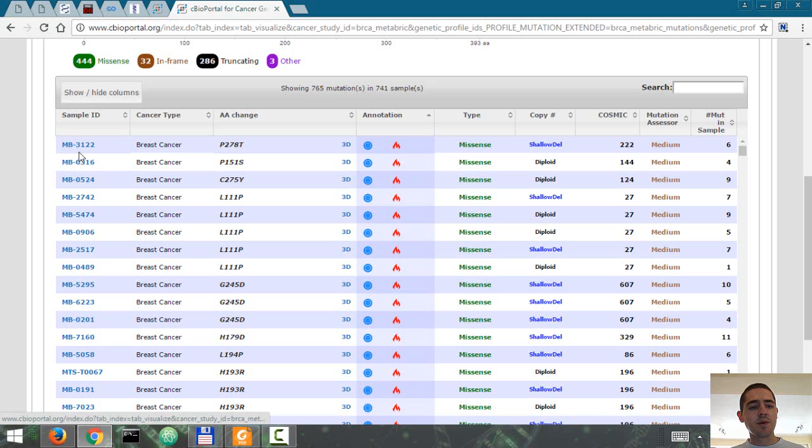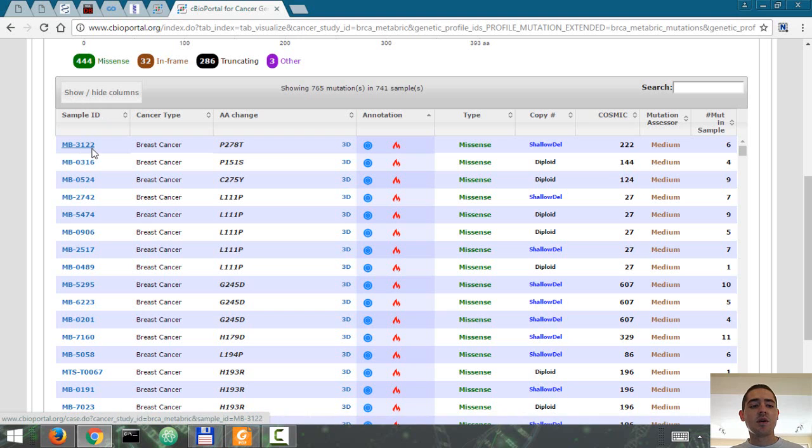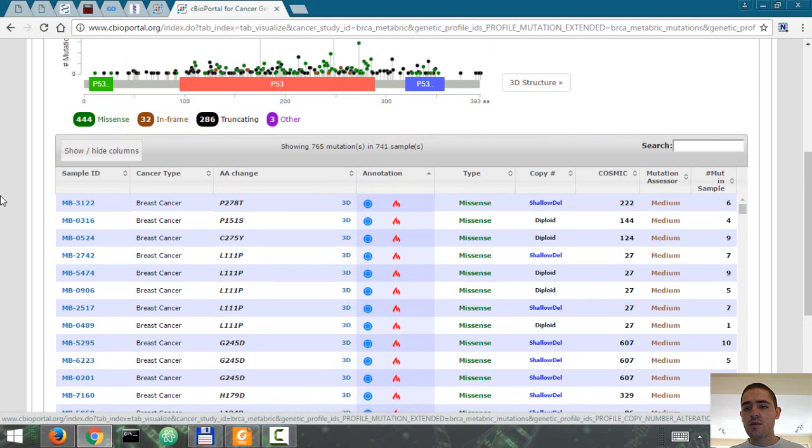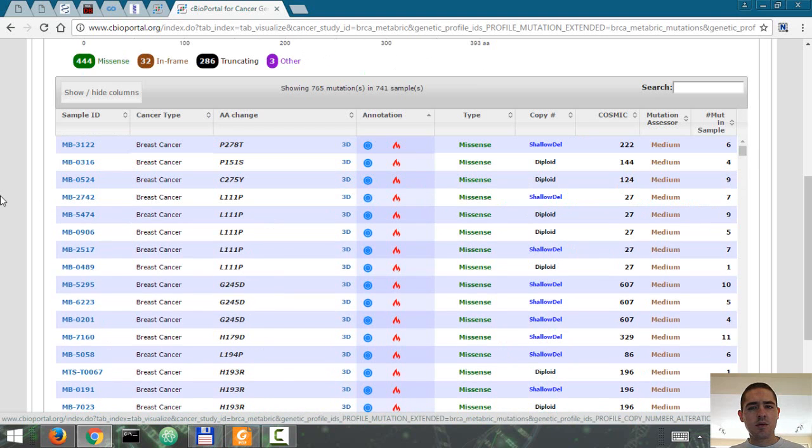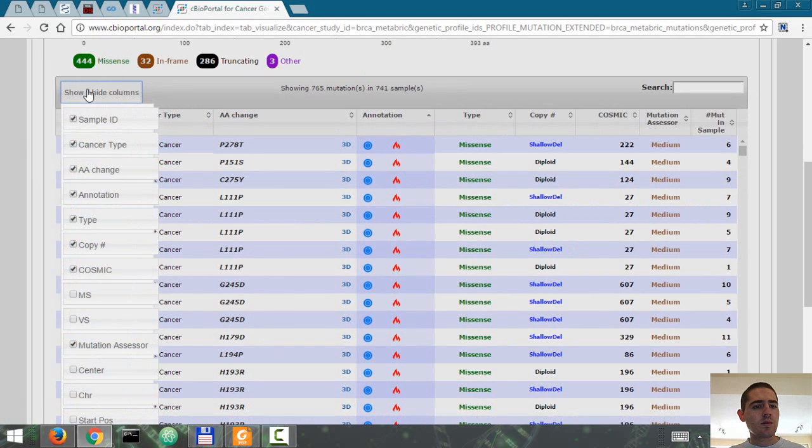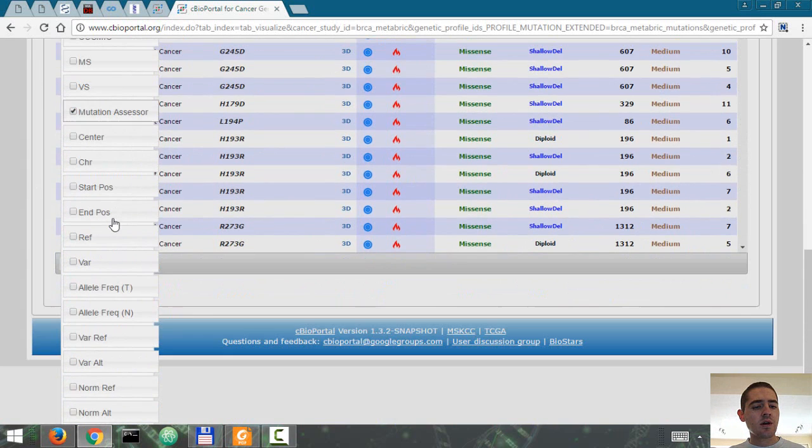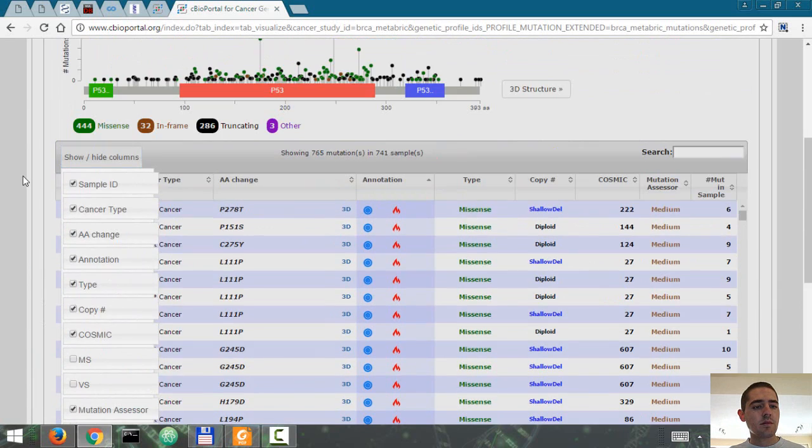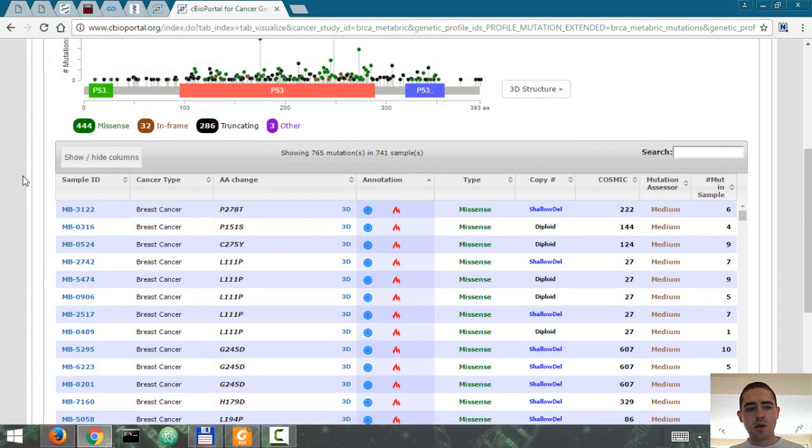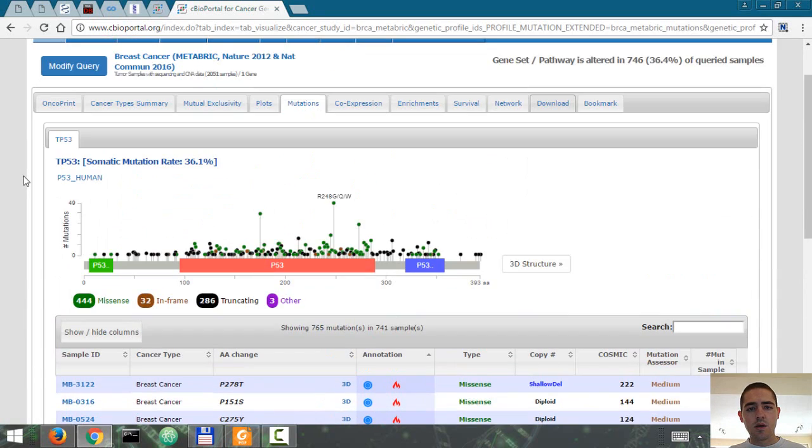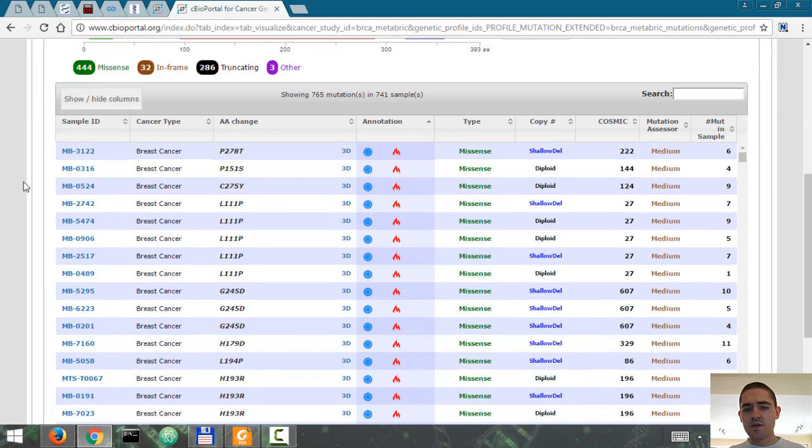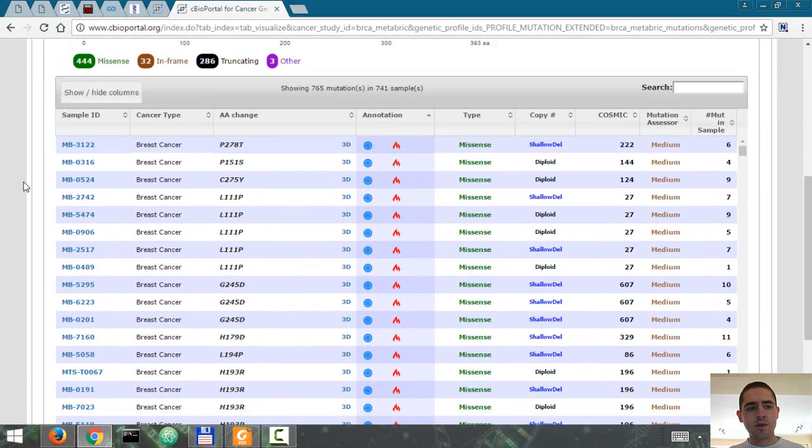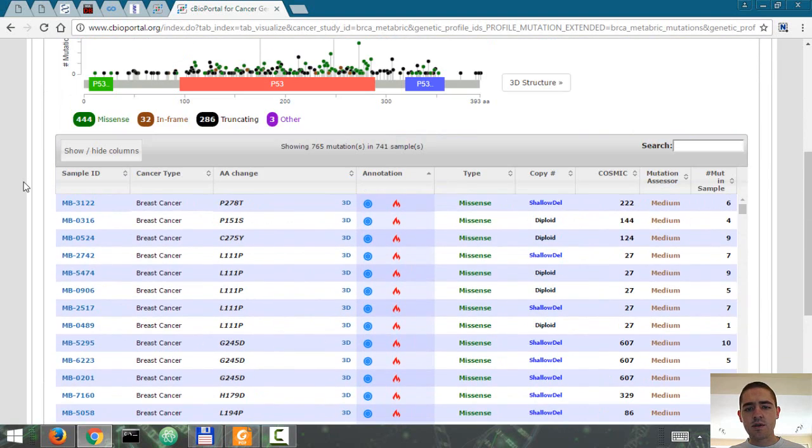The data is anonymized, so you only have a sample ID, not the actual name of the person, which wouldn't be appropriate. You can also select for other columns that you want to see.